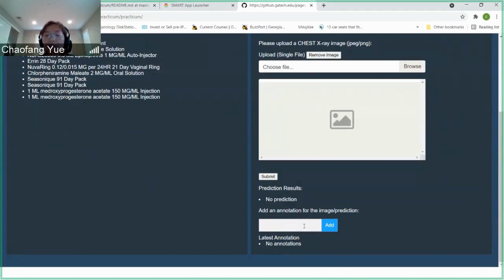We also have the annotation functionality here, although right now it's not integrated with the EHR system because the sandbox currently does not have the image resources linked. But we can have it for the future as we talked about in the presentation slides. For example, I can add a note here saying patient complains of shortness of breath. It shows the author who made the annotation, the time this note was made, and what the note message is. And this can be a nice functionality to be integrated with the image for later review purposes.